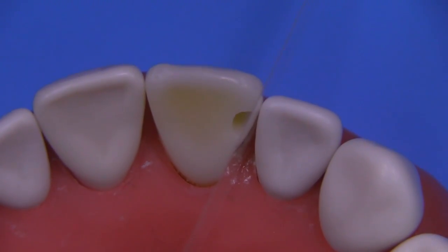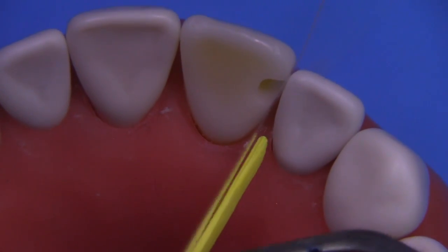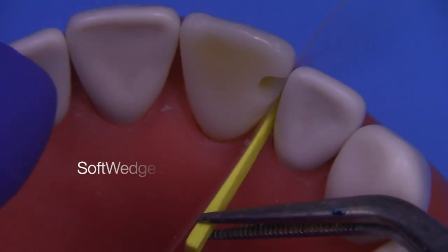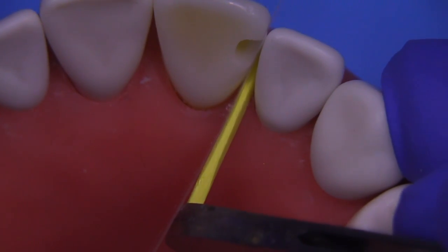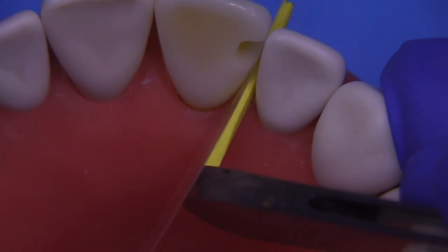Because this matrix strip is rather thick, being 50 microns, if you are not going to place a wedge, you may end up having a problem with reestablishing a contact. So I'm going to go ahead and use a Garrison soft wedge. This is the extra small size. You can use a wooden wedge of a different style if you like, and just insert this between the teeth to compensate for the thickness of that band.